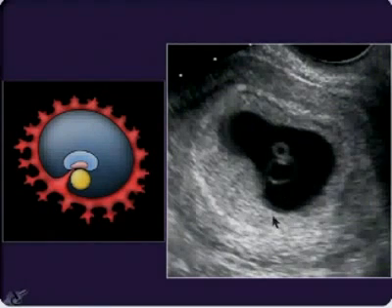Here's another one, and I just love this because it has everything in the world you could possibly want on a first trimester scan. Notice the thickening down in this area where we have both the decidua basalis and the chorionic frondosum. Then we have our double decidual sac with capsularis, endometrial cavity, parietalis out here. Then we have the yolk sac, the embryo, the amniotic cavity here, the chorionic cavity there. So we have just beautiful anatomy.